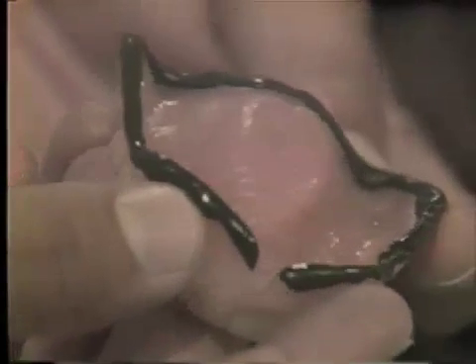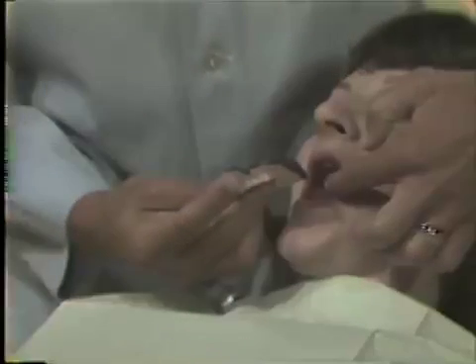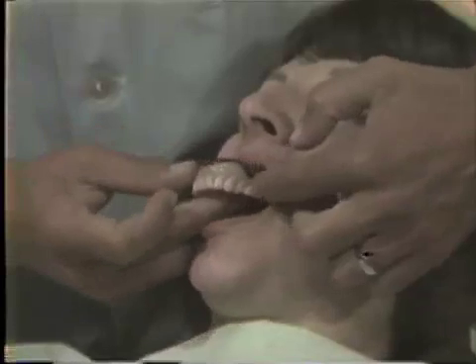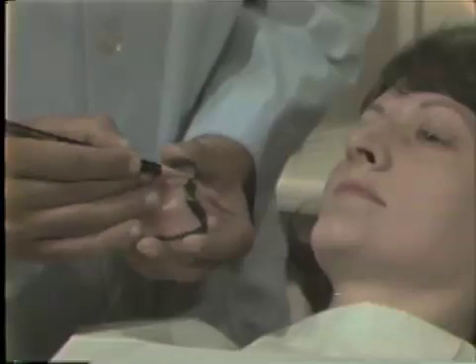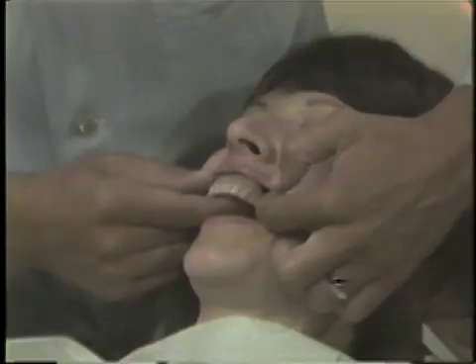The borders of the denture should be examined in the patient's mouth. Any borders that are short should be border molded with compound and checked again in the patient's mouth. The posterior border of the denture deserves special attention. This border should be checked with the indelible pencil.